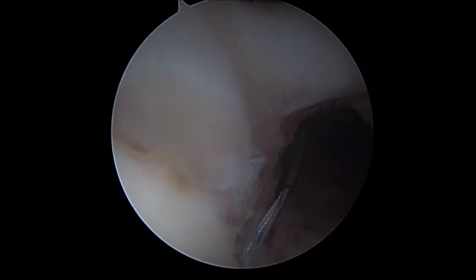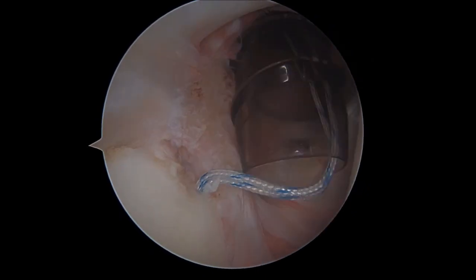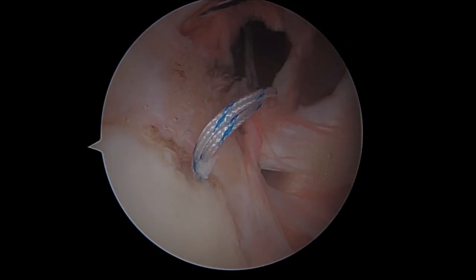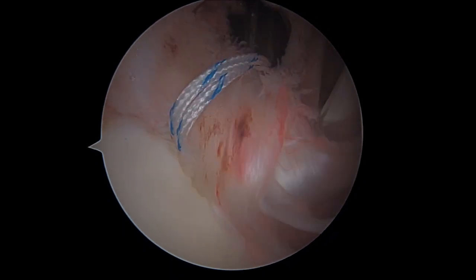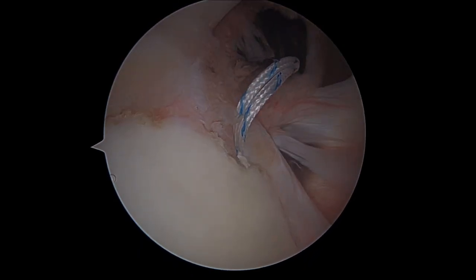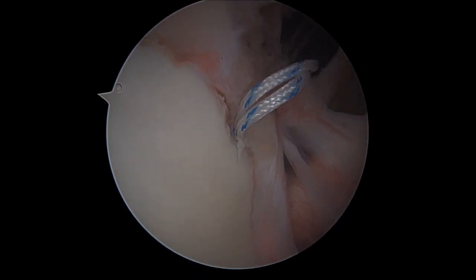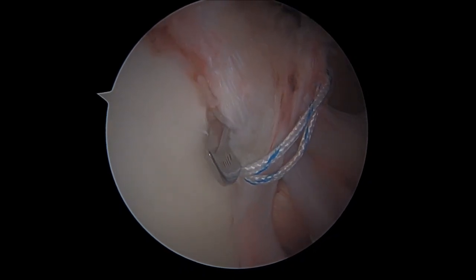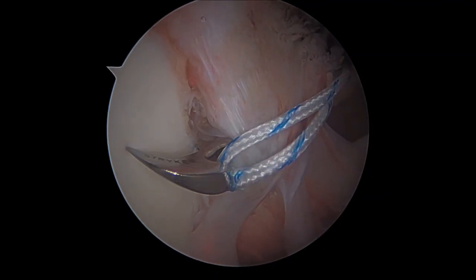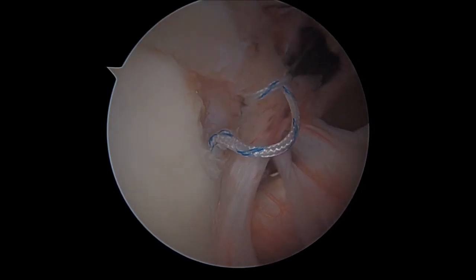The anchor offers us a double-tailed wire that we are able to recover by a retrograde device that passes through the capsule — in this case the anterior superior capsule — and under the labrum. It's a golden rule: through the capsule and under the labrum. This is what we have to do to correctly catch one of the two wires of the implant and to be able to recover it retrogradely, to correctly perform our arthroscopic knots that will fix the lesion.